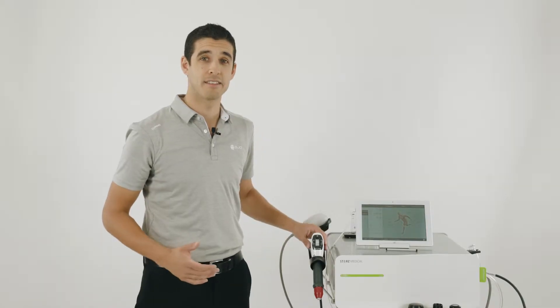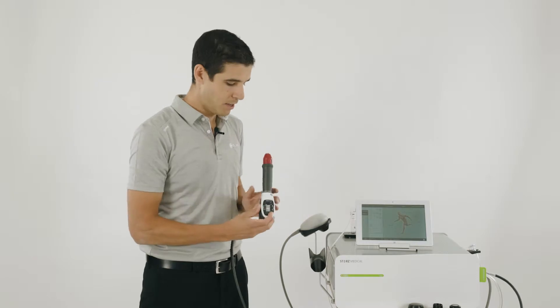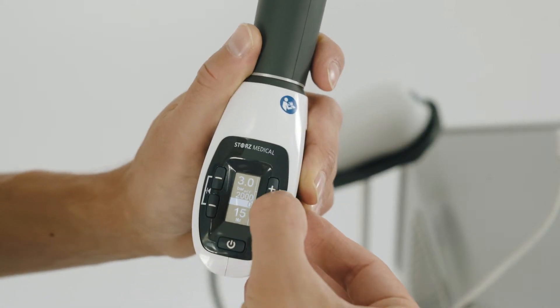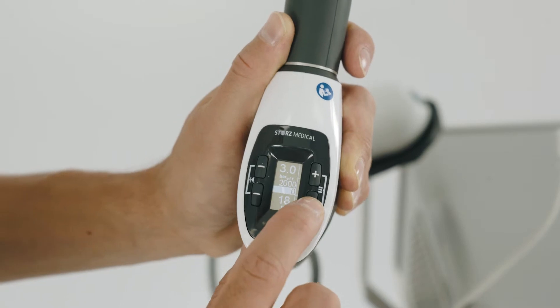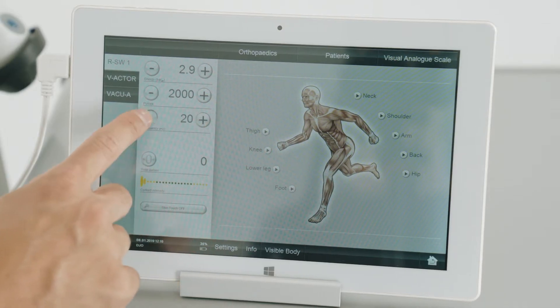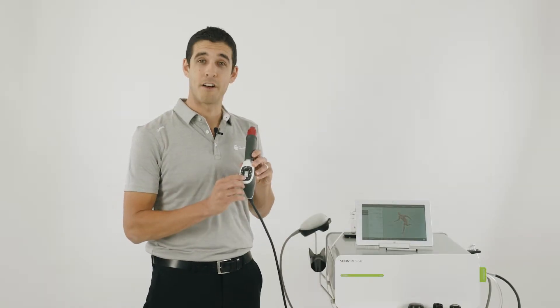The radial shockwave settings can be controlled via the handpiece or on the tablet. To increase the intensity, you can press the plus button on the handpiece or on the tablet. To increase the frequency, press the other plus button on the handpiece or on the tablet. The pulse counter can also be adjusted on the handpiece or the tablet. To start the treatment, press the power button on the handpiece.